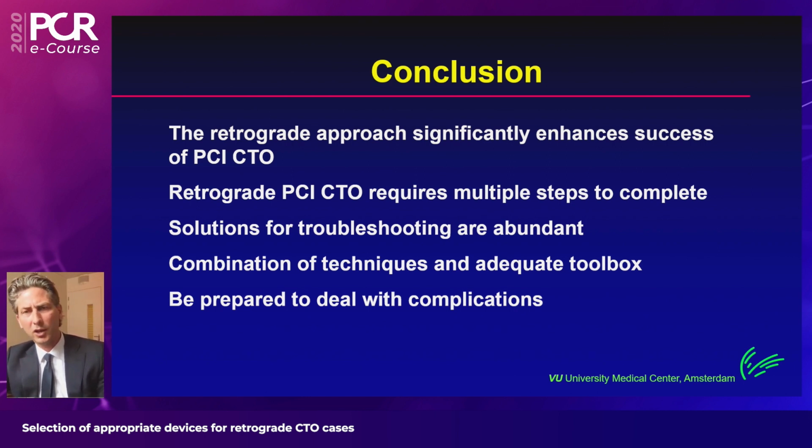You need to select the channel, wire the channel, and travel through the body of the CTO. You're frequently dealing with reverse procedures. In over 75% of cases, you're going to be committed to reverse CART, and you need to have all the steps and troubleshooting techniques to deal with complications, because complications are more frequent with the retrograde approach than with the antegrade approach. So learn all these tips and tricks and be prepared to deal with complications.